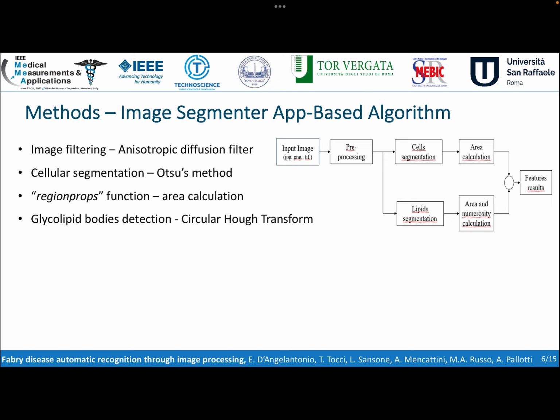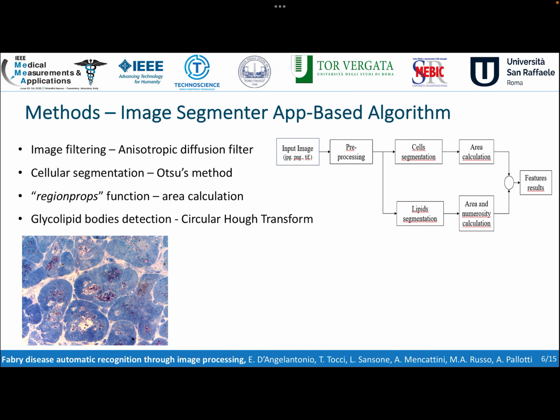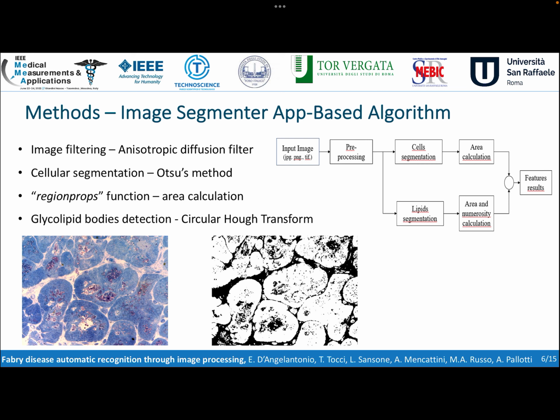The image processing software used are MATLAB, and in particular the image processing toolbox of MATLAB, and also the MATLAB mobile application, that is the application released by MathWorks for running MATLAB in the mobile devices. At the end, the last image processing software is the ImageJ software, a Java-based software entirely dedicated to the image processing and developed by the National Institute of Health.